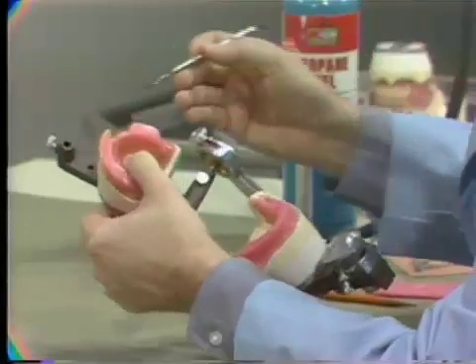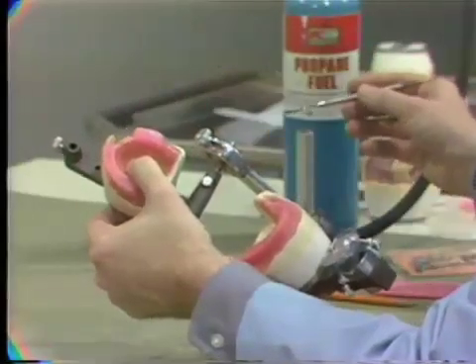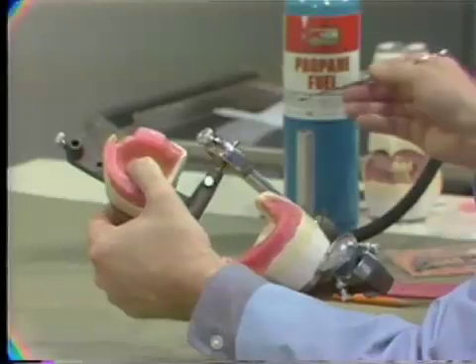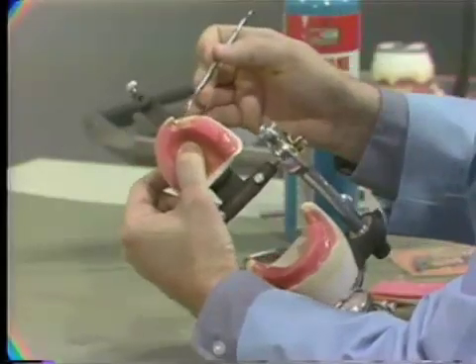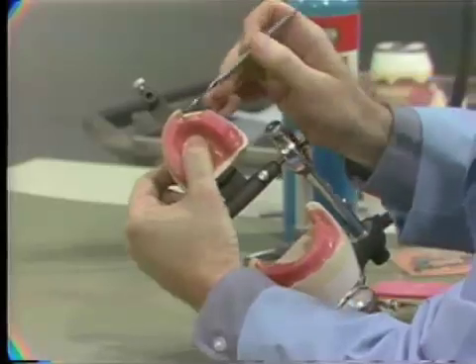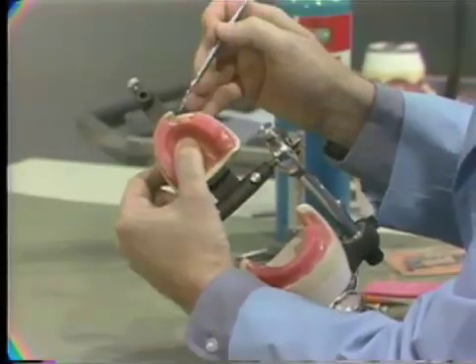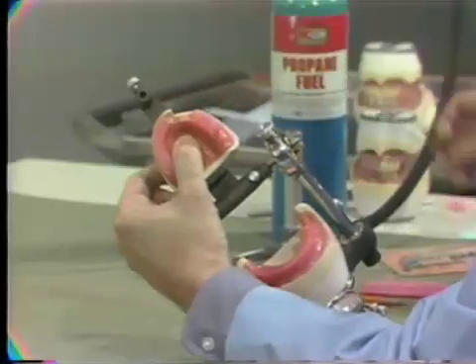And at this time I'm going to use a little more wax, being careful not to use an excessive amount of wax, because these dentures do have to be waxed to look aesthetic before they are processed, and if we have too much wax, it's as much of a job to wax the denture as it was to set the teeth, and that shouldn't be.